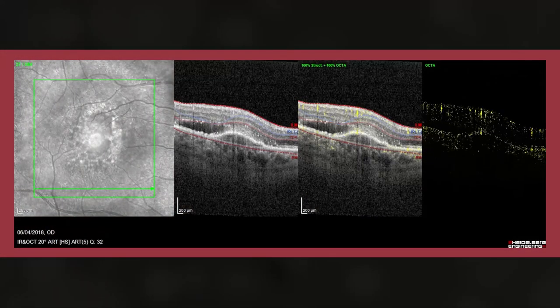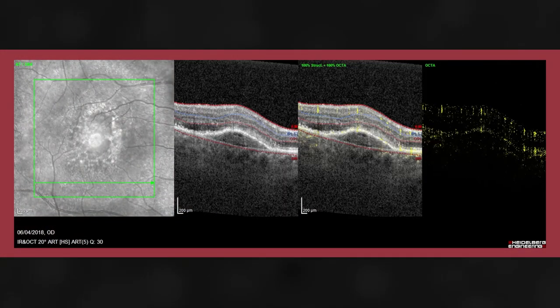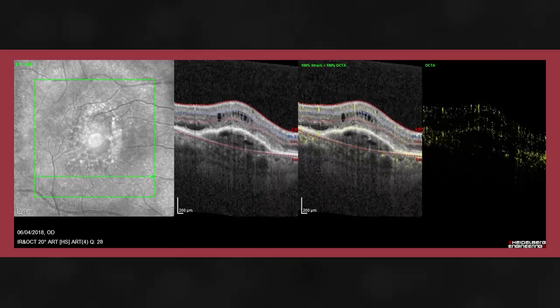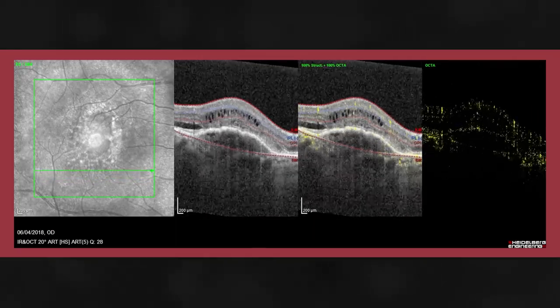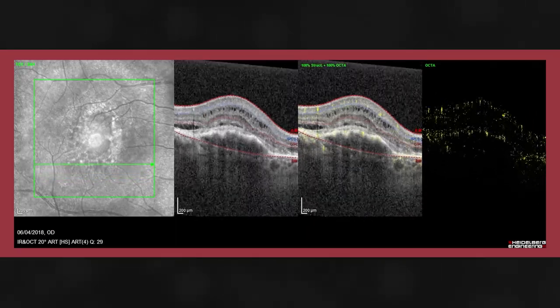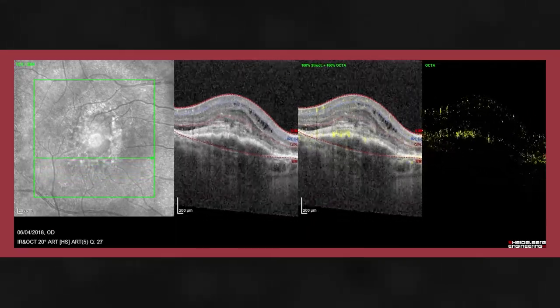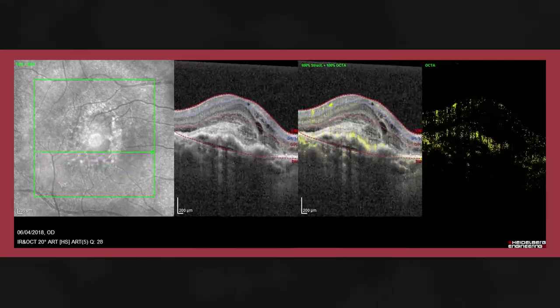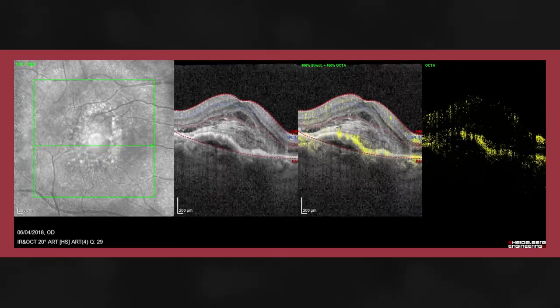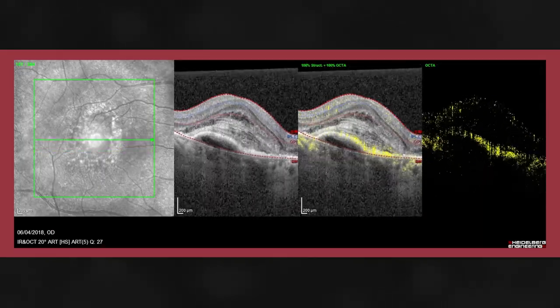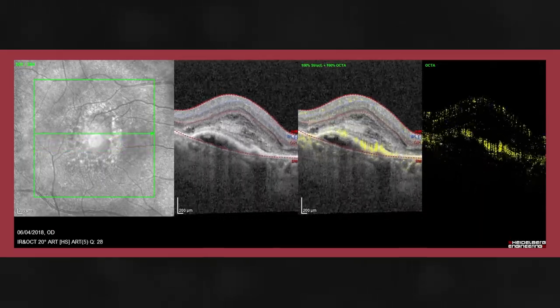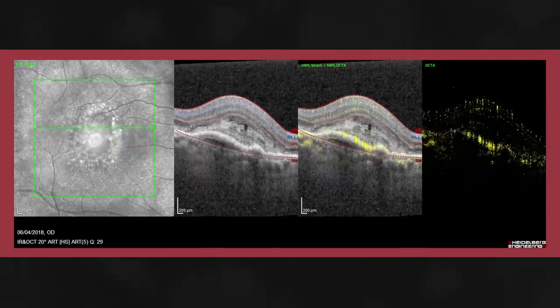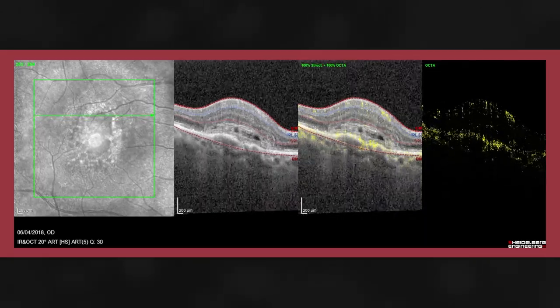In this example, we see a pigment epithelial detachment. However, we see abnormal flow associated with this. This may be indicative of co-located neovascularization.